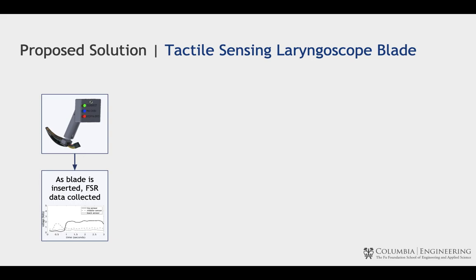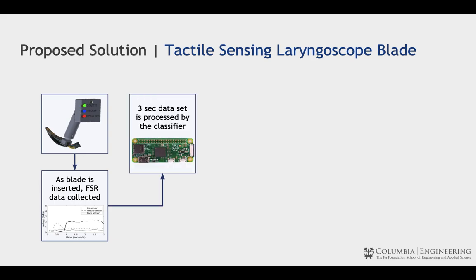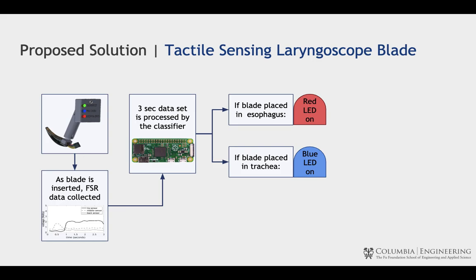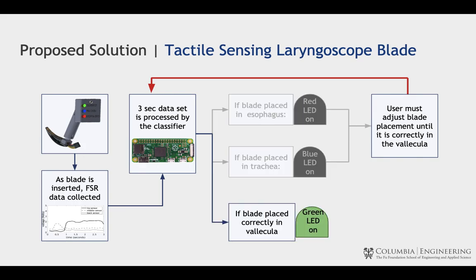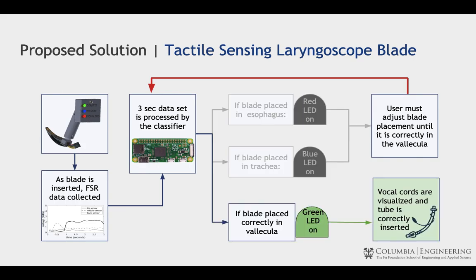As the blade is inserted, the force sensors begin to collect data. The Pi then compares the collected data to previously collected expert intubist data. If the blade is incorrectly placed, the warning LEDs turn on. The user must readjust until the laryngoscope is correctly placed, in which case the green light turns on, indicating that it's appropriate to insert the endotracheal tube.